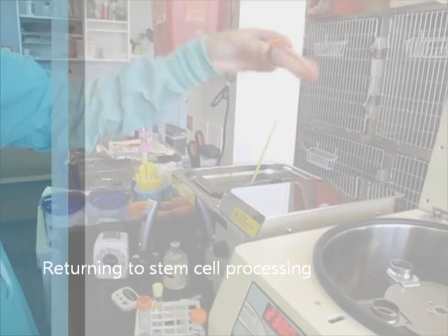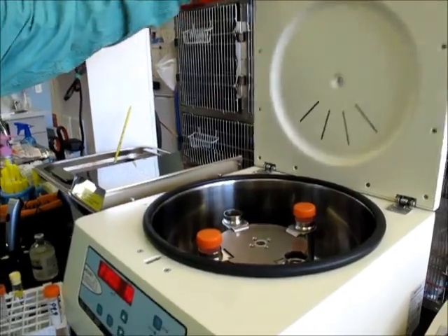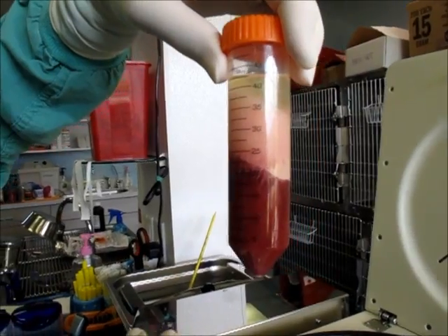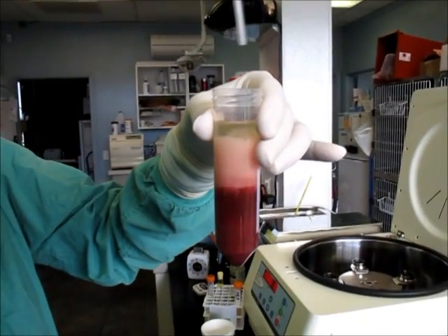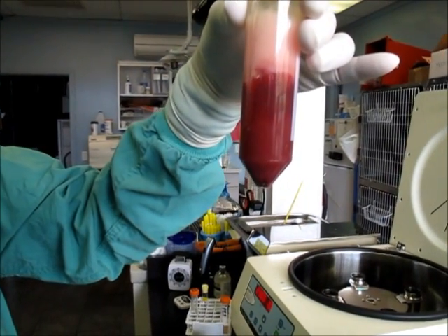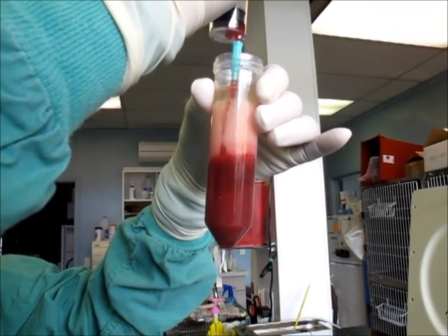After incubating for 45 minutes, the sample is pretty liquid. Now we're going to spin it in the centrifuge to spin out the stem cells. This section down here is called the stromal vascular fraction. It contains the stem cells and associated helper cells.